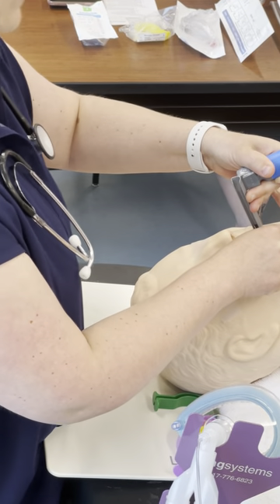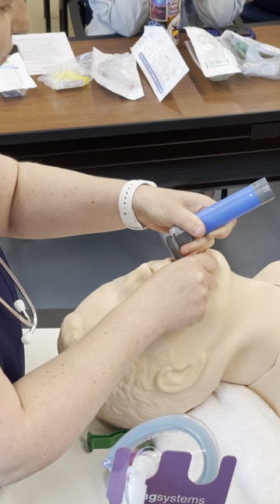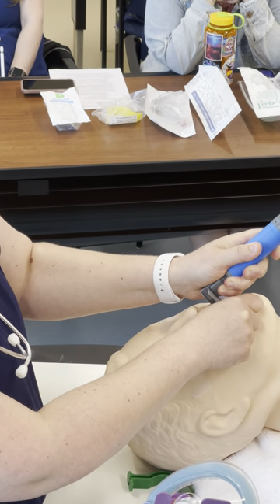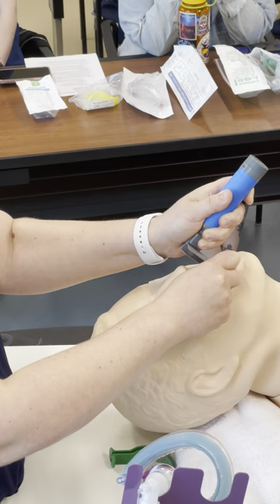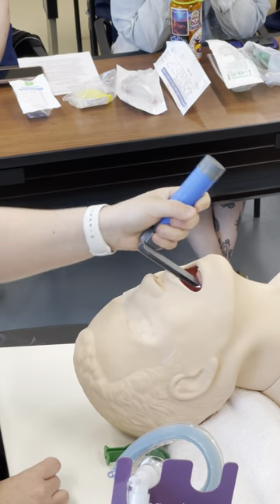Start slightly on the right side of the tongue and walk your blade down — I can see the hard palate, now the soft palate, now I start to lift. I can see the epiglottis. I lift and I see the cords. Notice I am not cranking back at all.